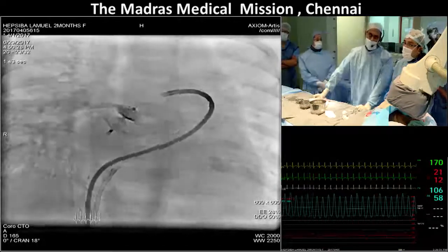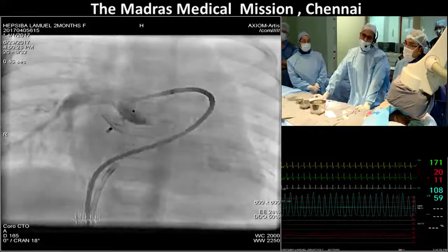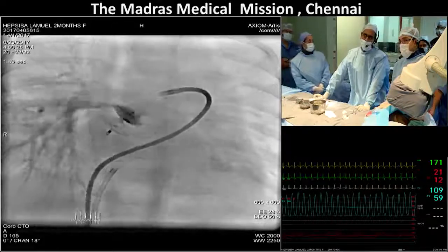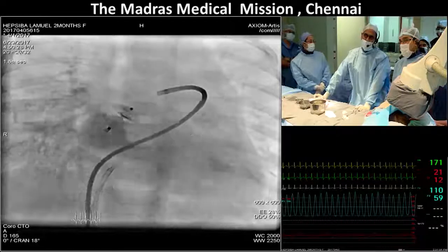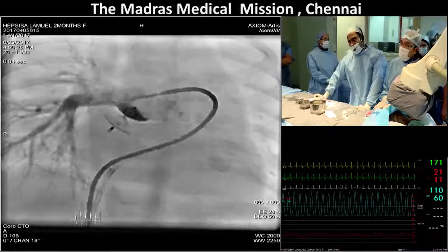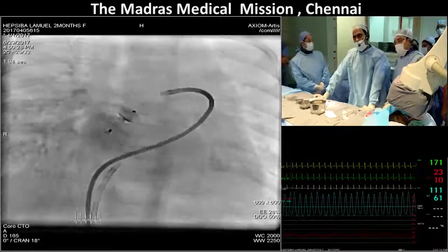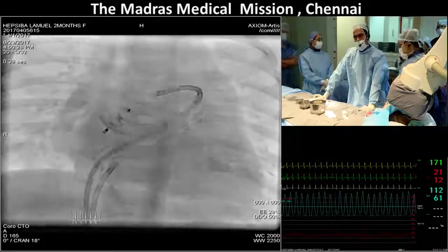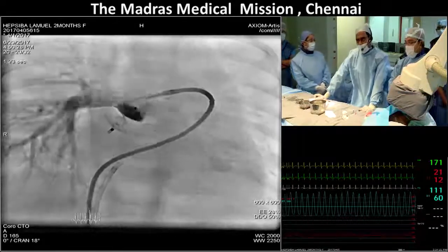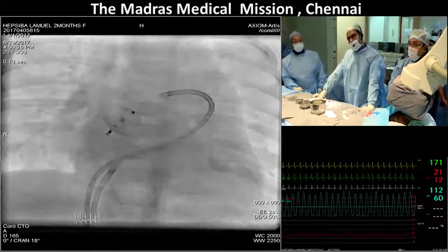We can see that the flow has almost stopped even now. Maybe there is a little bit of foaming. What will be interesting will be to decide on the antiplatelet or anticoagulation strategy. Now, Dr. Shan, who is my colleague, was presenting the different types of right pulmonary artery to left atrial windows. Some of them are associated with an aneurysmal pouch in the left atrium, as it is in this patient also. So there may be some slow flow in some corners of the left atrium.